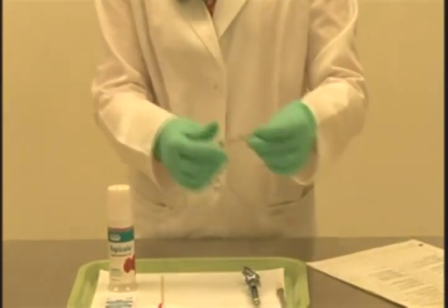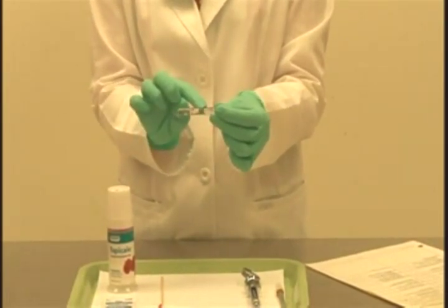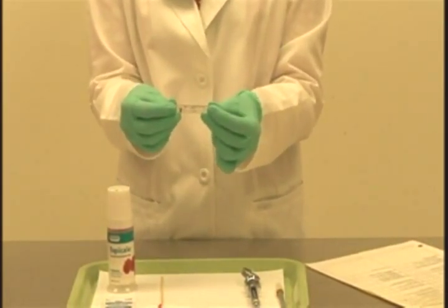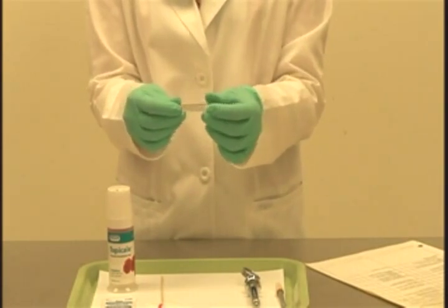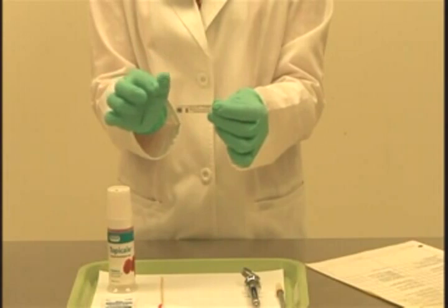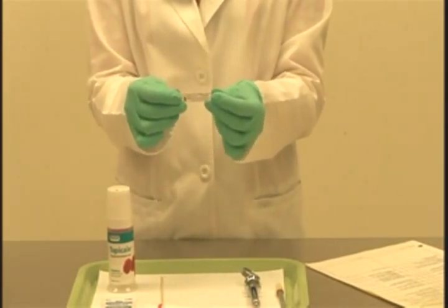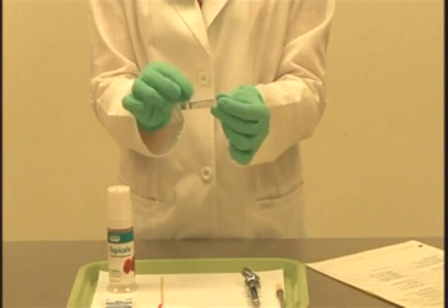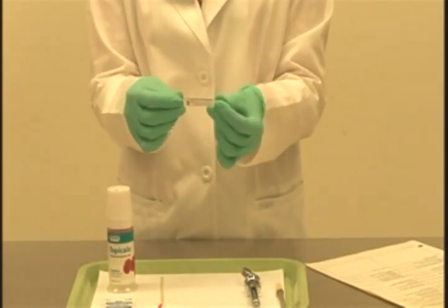With respect to our anesthetic carpule, you want to make sure you check the type of anesthetic and confirm it is the correct one. You also want to check the expiration date — the expiration on this one is 1-13, meaning January 2013, so we know we can use this anesthetic. You will confirm the date with the clinician as you go through the procedure.